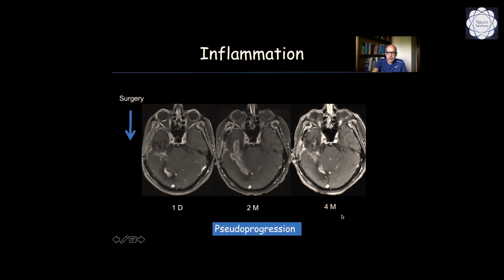And in the 4th month after the surgery, these characteristics improve a lot. So it's important to recognize this finding, because that's why we don't perform an MR in the 2nd month. We usually defer this control to the 3rd month at least.